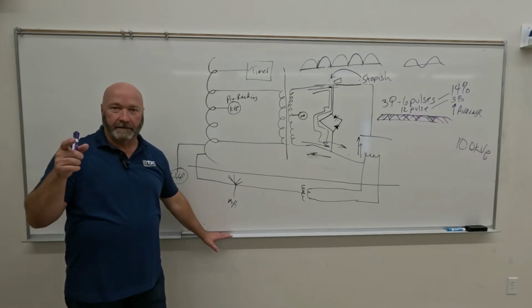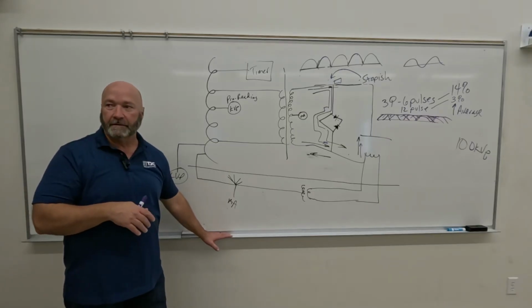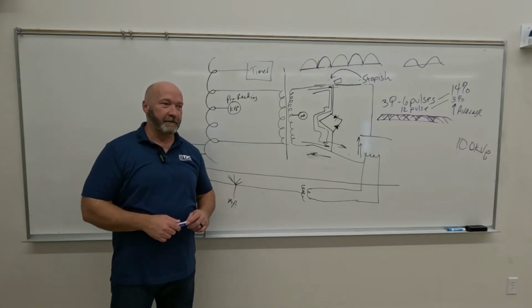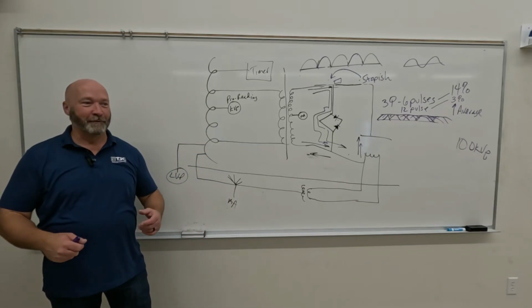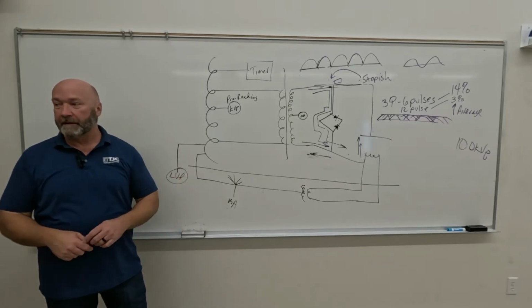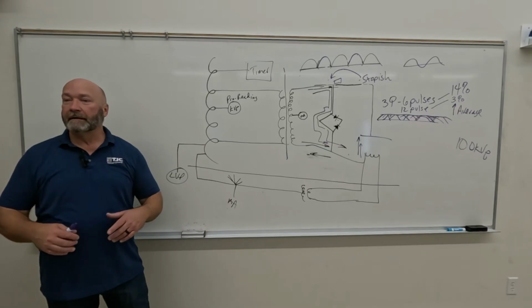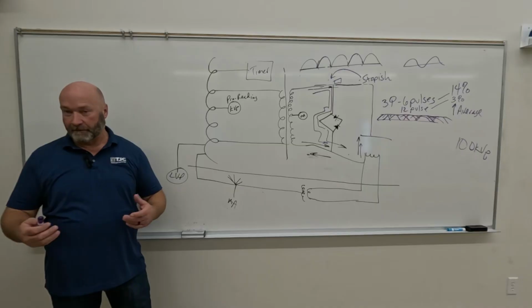You can tell if it's got batteries or if it doesn't have batteries. First off, if it doesn't have batteries, you've got to plug it in to use it. If it does have batteries, you can tell as soon as you get on the elevator. Everybody freaks out when you get on the elevator because it dips, right? That's because batteries are heavy. If you've never picked up a car battery, a car battery is probably 60 to 80 pounds. They're heavy. And that portable is full of them. Don't run over your foot or anybody else's foot with a portable.